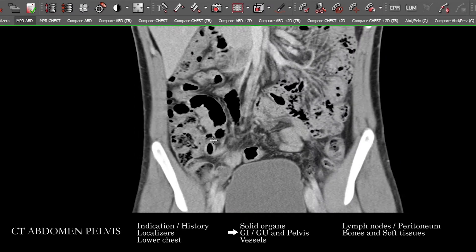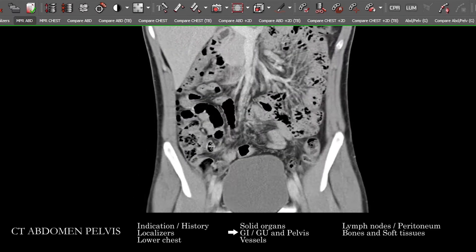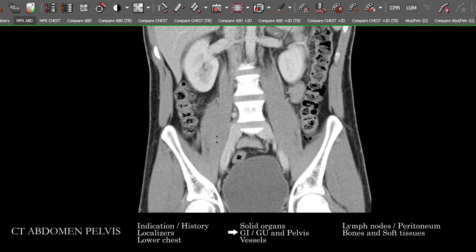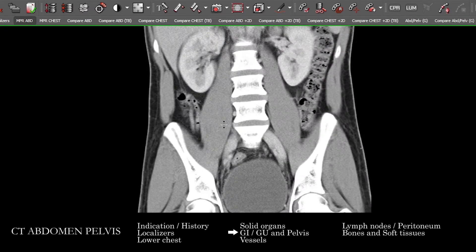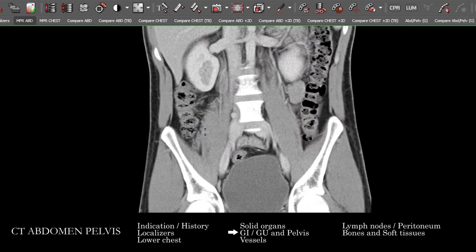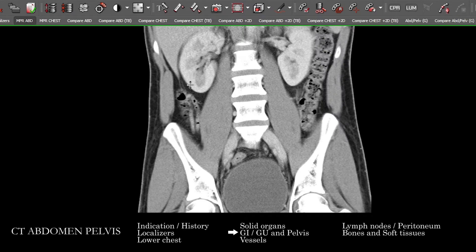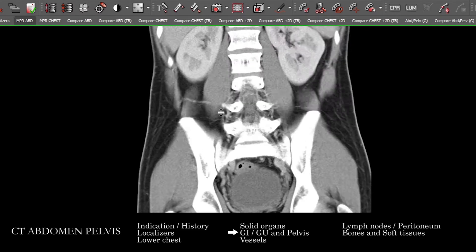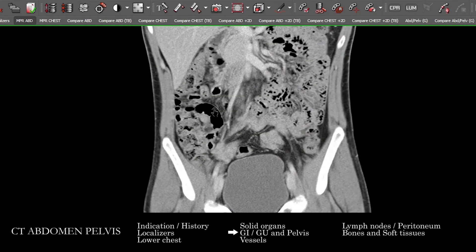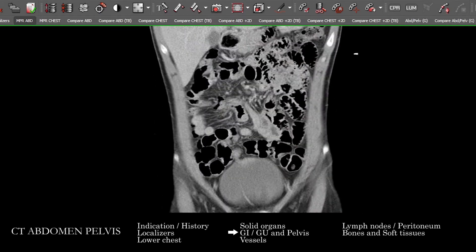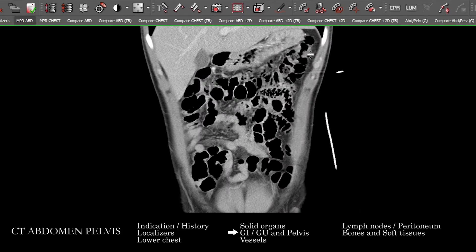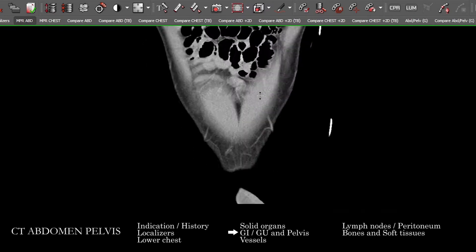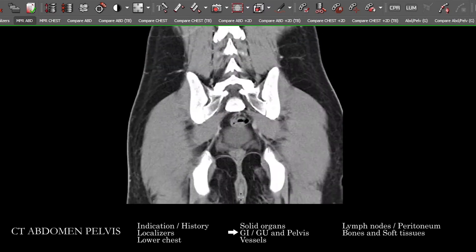Frequently the appendix will come off the cecum inferiorly to the ileocecal junction. In this particular patient, scrolling back — I particularly like the coronals for looking at the GI tract — you can see that the appendix arises posteriorly and courses almost in a retrocecal distribution posteriorly. This appendix appears normal; I want to check the appendix on every patient as best you can see it. Then we're going to follow the colon around from its ascending portion to the transverse portion — hepatic flexure over to the splenic flexure — all the way down into the sigmoid and then the rectosigmoid, rectal vault, and all the way down to the anus.